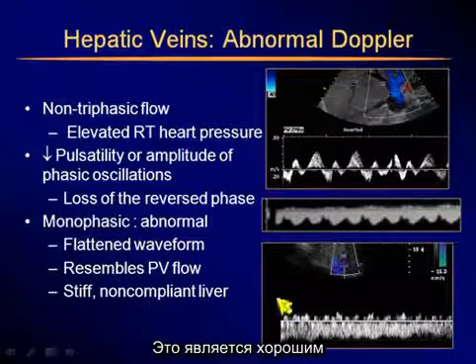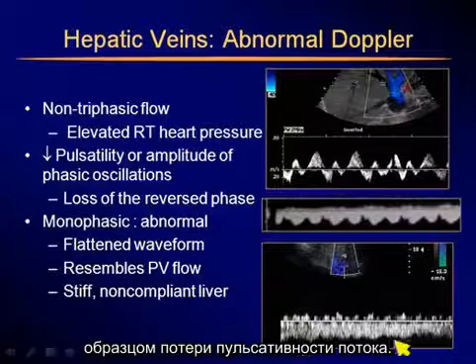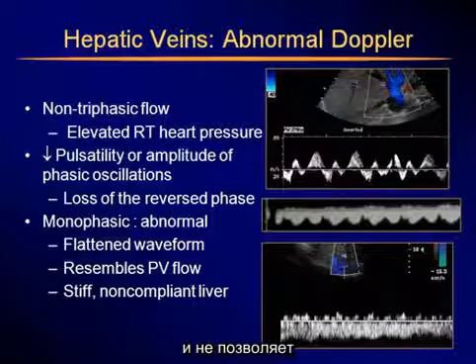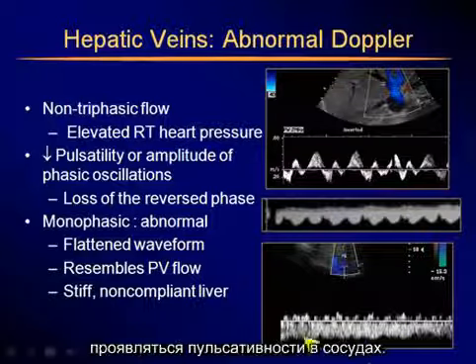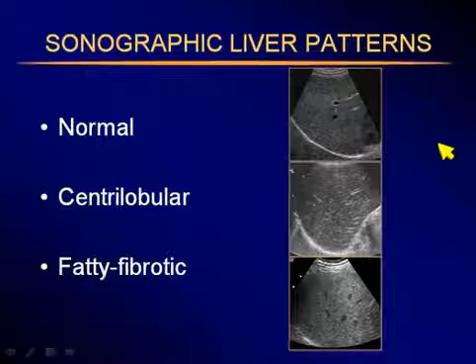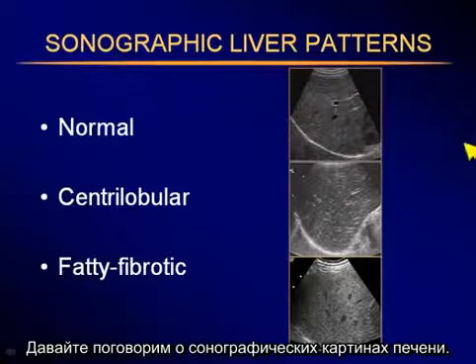So it should be a nice pulsatile pattern, and all of a sudden now it's flat. It's because the liver is stiff, the liver is non-compliant, and does not allow this wave to be reflected in the vessels. So now let's talk about sonographic liver patterns.